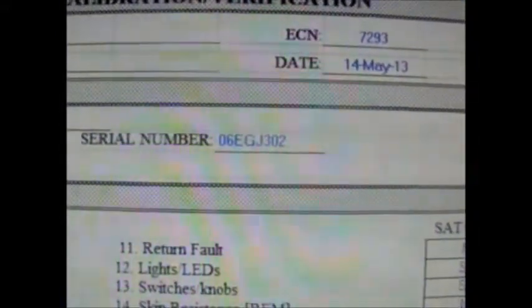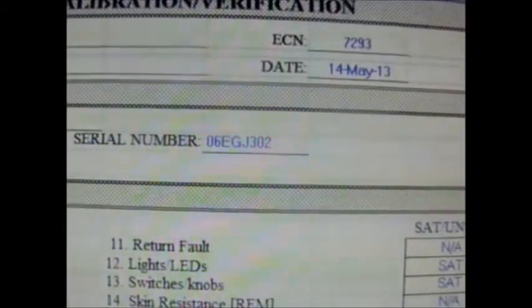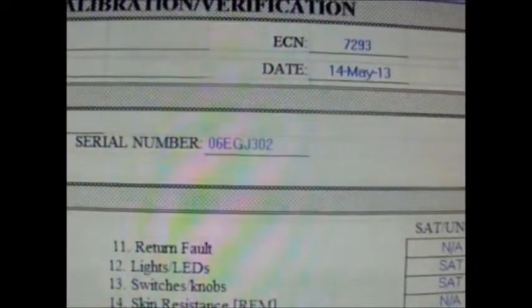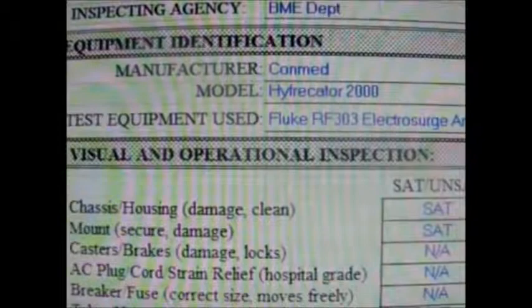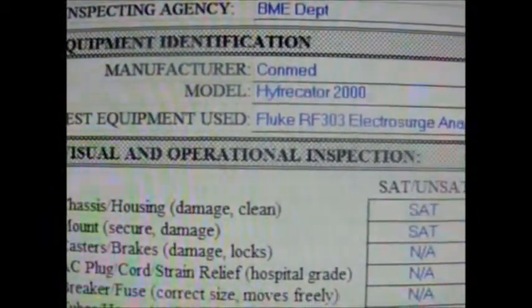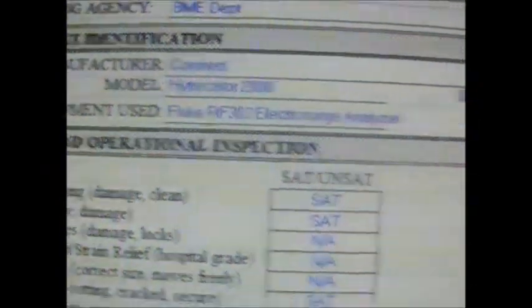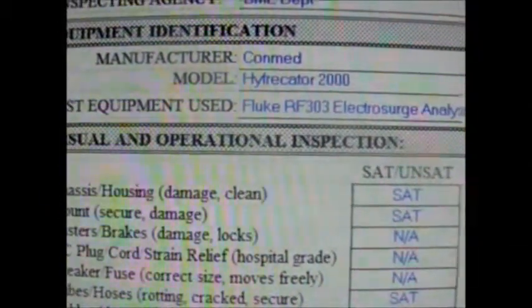We also have the ECN, or Equipment Control Number, which is the Index Number or Asset Tag, followed by the Date. We have the Equipment Manufacturer, which is Conmed, the Model — Hyfrecator 2000 — and Serial Number, followed by the Test Equipment, the RF-303 Electrosurge Analyzer.